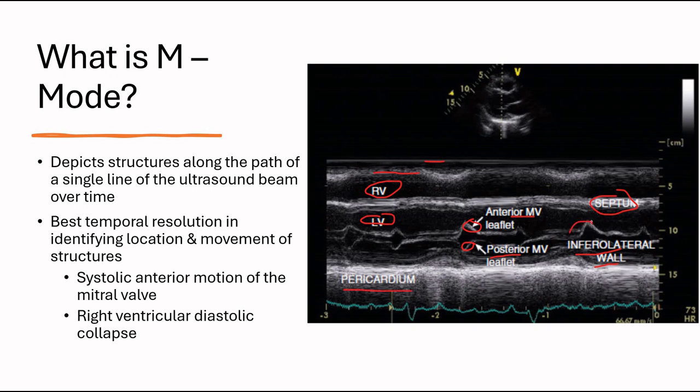So in diastole, these mitral valves open and get close, and the anterior leaflet gets closer to the septum, and in systole the valves close, such as so.